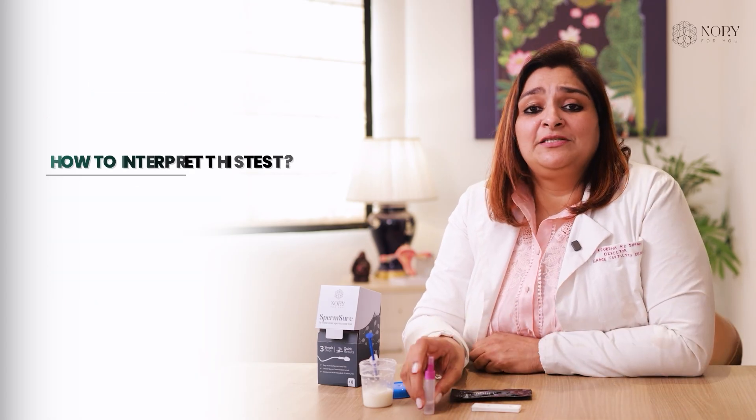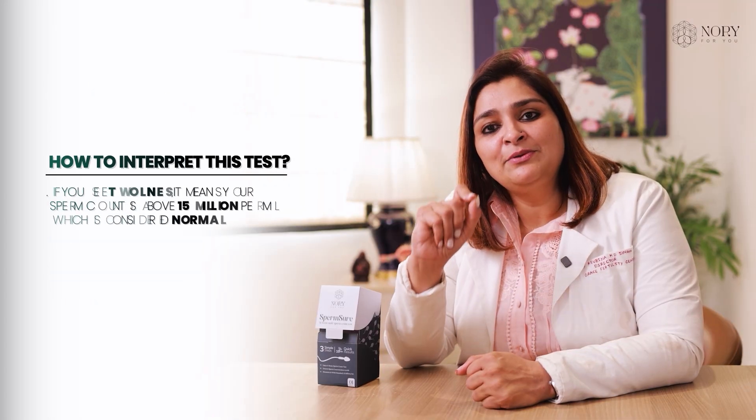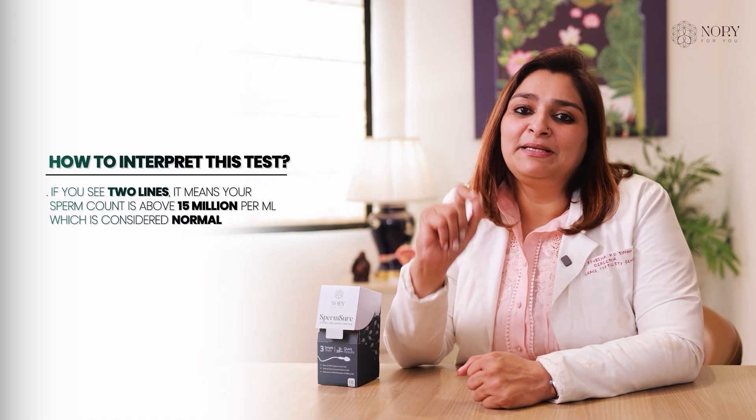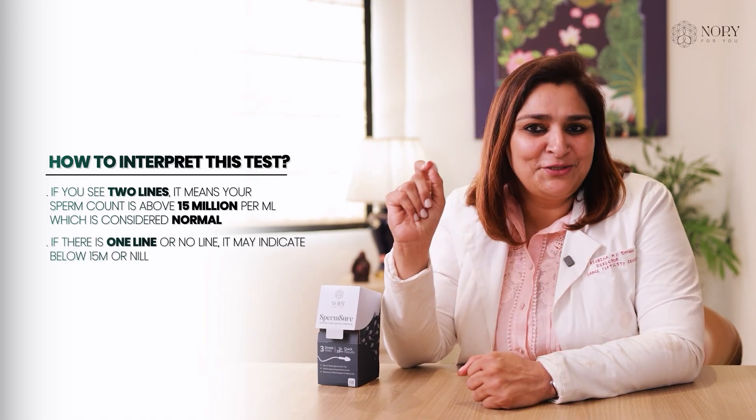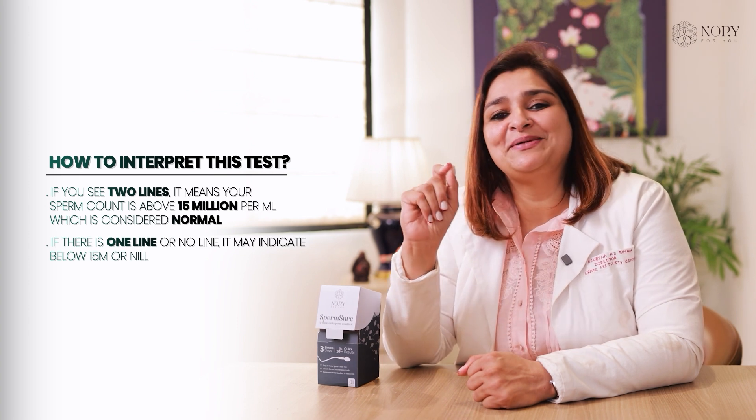How to interpret this test? If your sperm count is more than 15 million per ml, the test will show 2 lines — that means good news, your sperm count is absolutely normal.